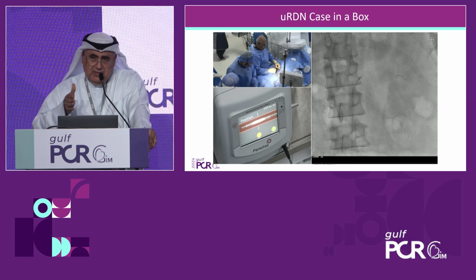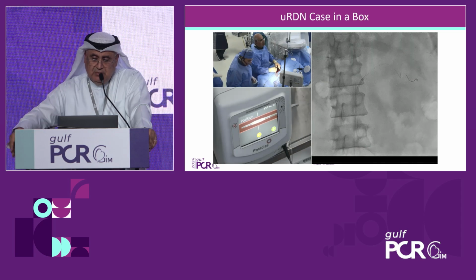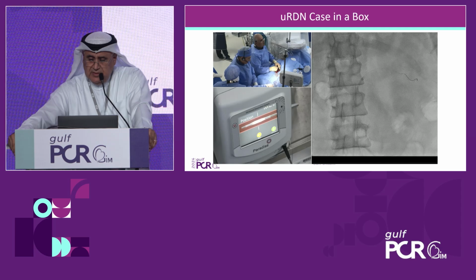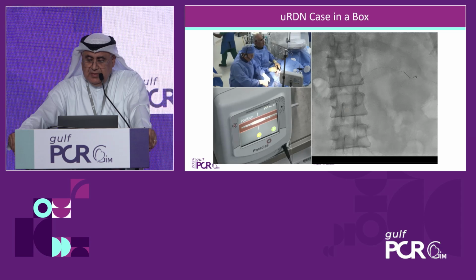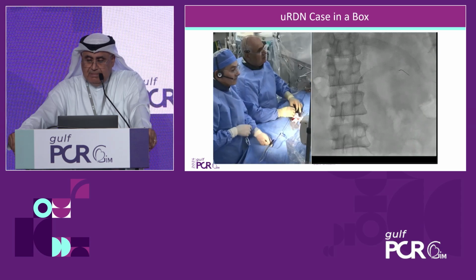Though this went exactly as has been described in the table, the size was supposed to go with a 6, with a 5, because it was 4.9, sorry. So after that balloon was positioned, yeah, that is how it should look like now.